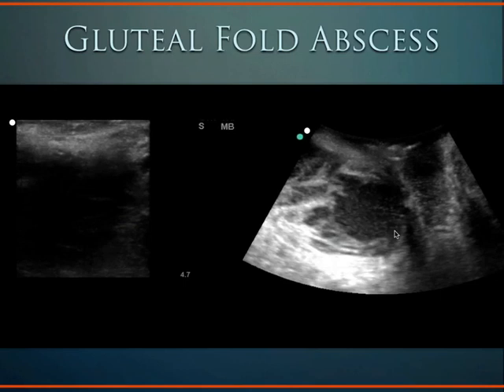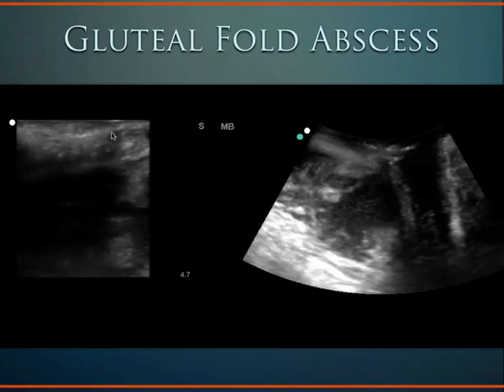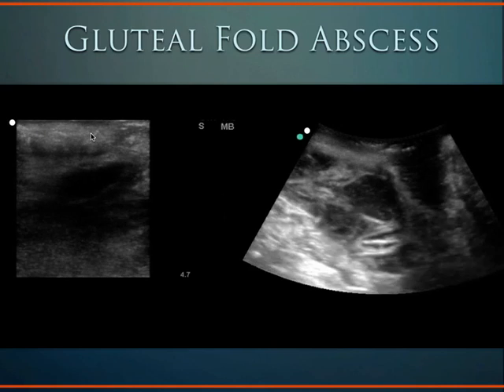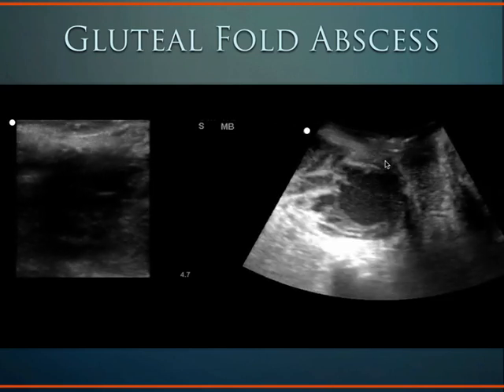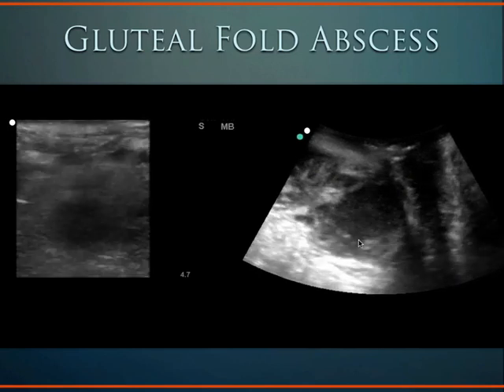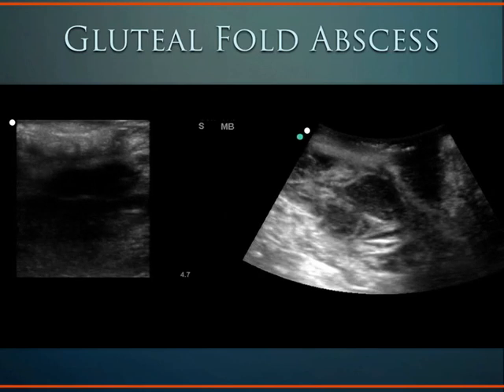It turned out it was a very large abscess that went to surgery to have this area drained. Interestingly, on the skin line, there was no evidence of any cobblestoning or cellulitis at all. Just normal soft tissue here. No evidence of cobblestoning. His skin wasn't even red. He just complained of severe low back pain. In fact, the resident taking care of the patient ordered some x-rays which were negative. They didn't see any evidence of abscess on the x-rays, which you wouldn't expect to. The bones looked okay, but it wasn't until we did this ultrasound that we saw he had this severe abscess there.